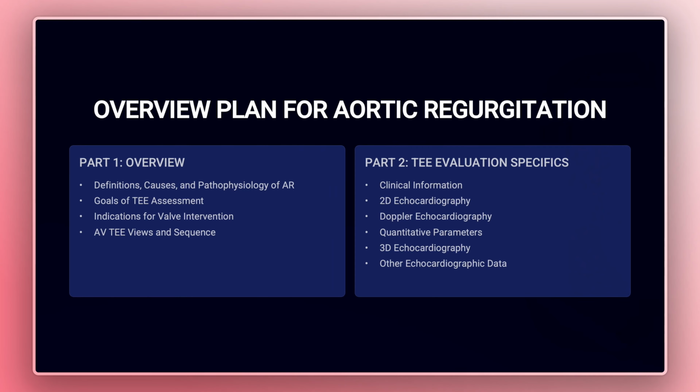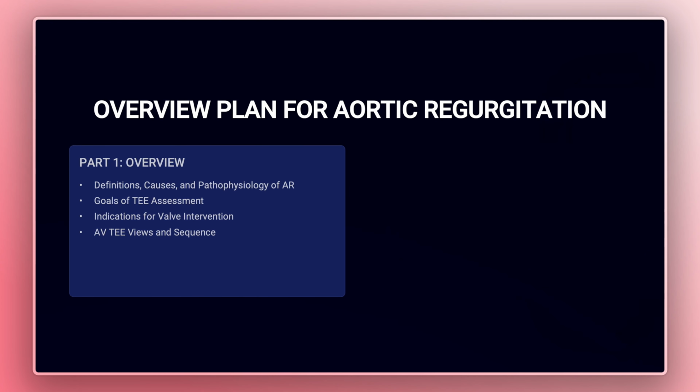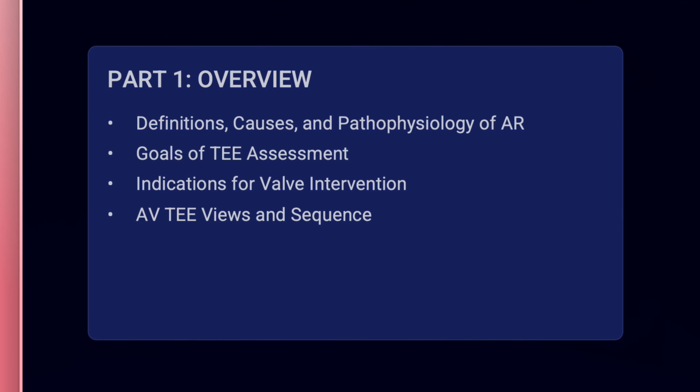Part 1, which we're going to be covering today, will consist of the definitions, causes, and pathophysiology of aortic regurgitation, goals of your TEE assessment, indications for valve intervention, and also aortic valve TEE views and the TEE exam sequence when interrogating an aortic valve.